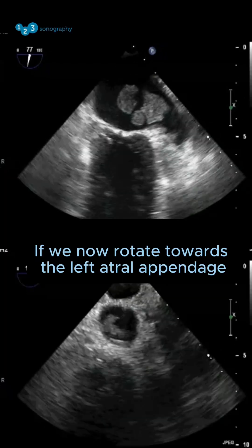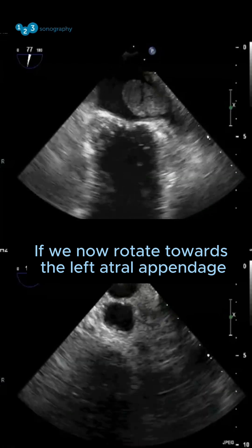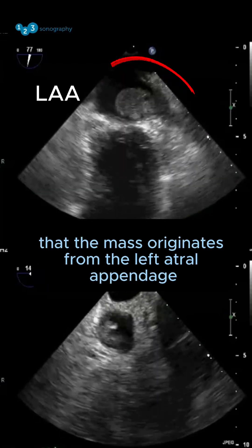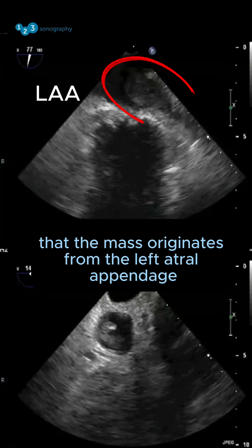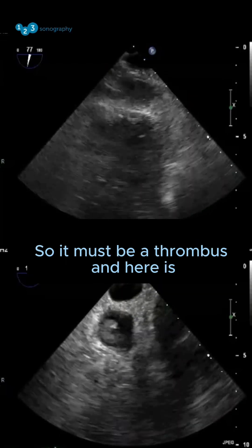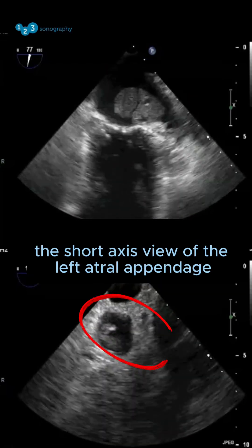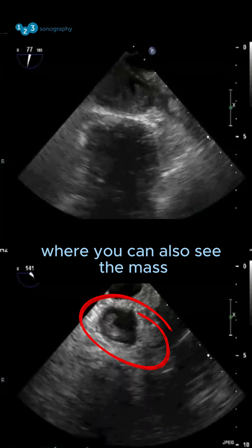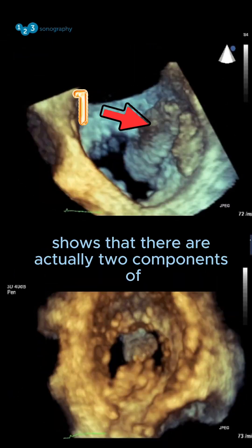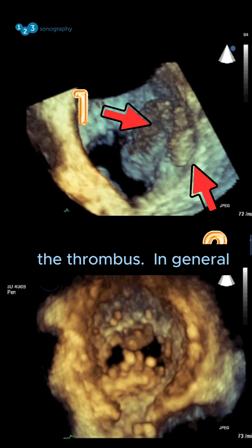If we now rotate towards the left atrial appendage, you can see that the mass originates from the left atrial appendage, so it must be a thrombus. Here is the short-axis view of the left atrial appendage where you can also see the mass. The 3D study shows that there are actually two components of the thrombus.